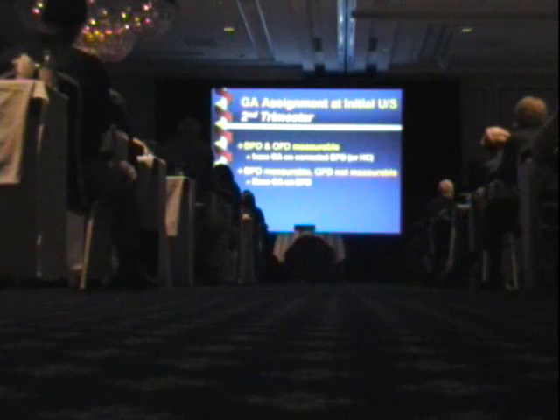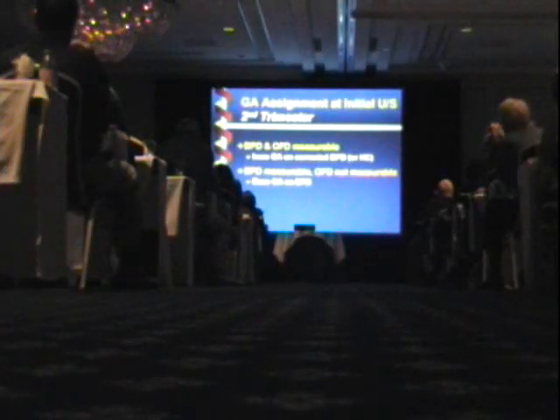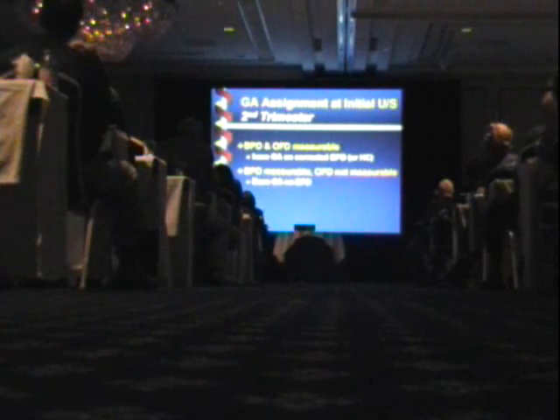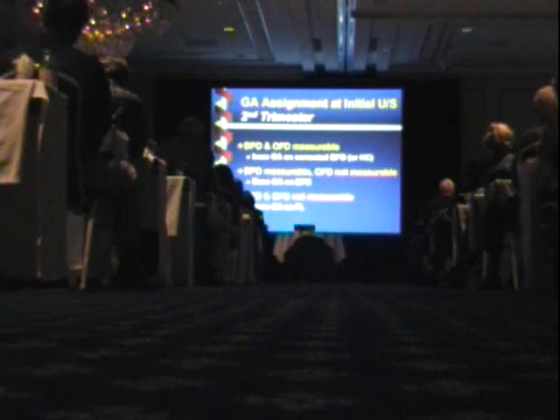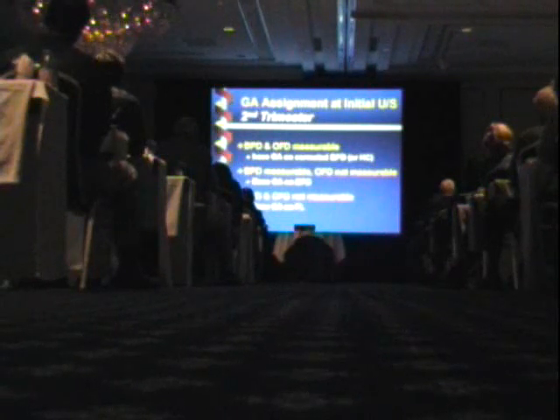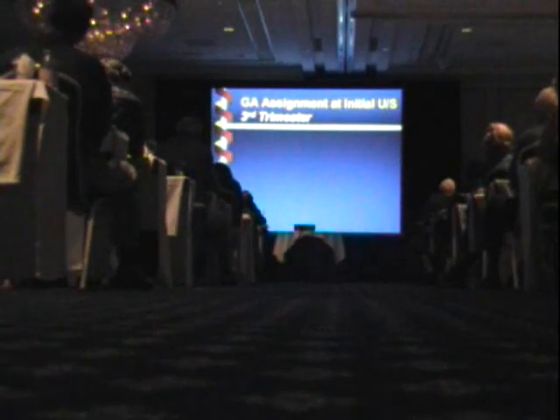If we can measure the biparietal diameter, but we can't measure the front-to-back occipital-frontal diameter, which sometimes happens when the head is lying low in the pelvis, we base the gestational age on the biparietal diameter itself. If we can't measure the head at all because it's really socked way down in the lower segment, then we'll base the gestational age on the femur length. This is in the second trimester. Again, if the initial ultrasound is in the second trimester.